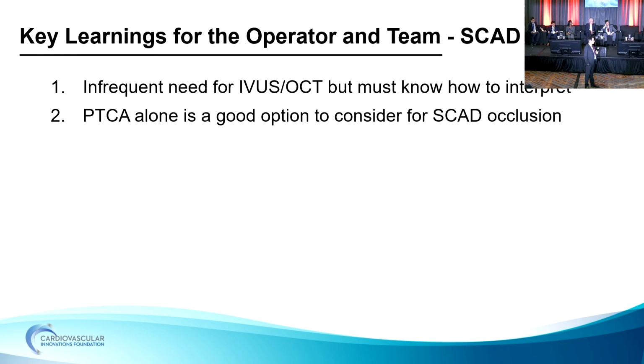In that case, with the left main dissection, I was able to do a 2-stent strategy, fenestrating everything on an Impella. She survived. But the point I wanted to make is that traditional stenting was just plain wrong. You're just pushing a hematoma distally or proximally, shoving branches and everything. I think the key element is to evacuate the hematoma in some way.